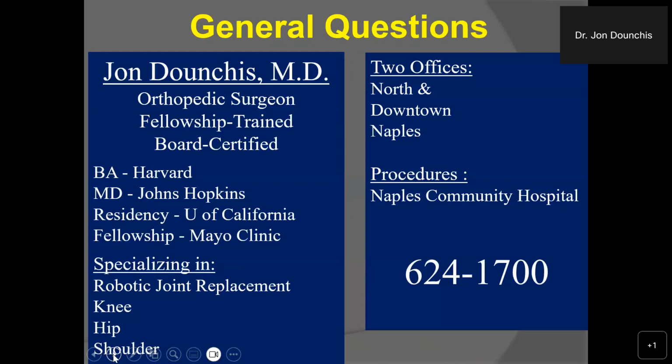So let's take a step back and reiterate and overview the implications and evolution of robotic surgery. So starting again in 2009, we embarked first on the partial knee platform, then the total hip platform, and then the total knee platform, utilizing three-dimensional, robust imagery of the entire extremity, both for the knee and the hip procedures. This is based on CT technology. In addition, both pre-op and in surgery, we add further information regarding the joint function with regards to the ligament function, kneecap function.